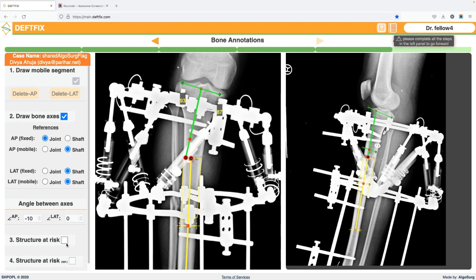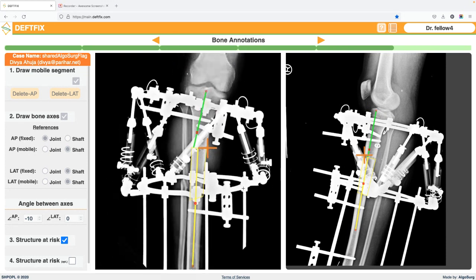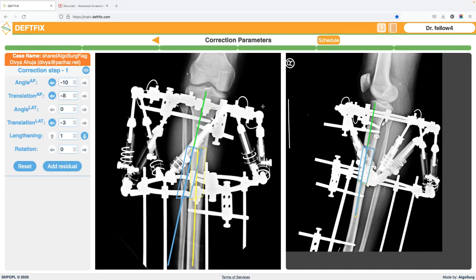We mark the structure at risk on the concave side. We are also going to correct some rotational deformity. In this case we will be internally rotating the limb, so this fragment is going to move to the right side. The structure at risk can be placed on the anterior side or midline — whichever is chosen will be correct. Then we go ahead and calculate.